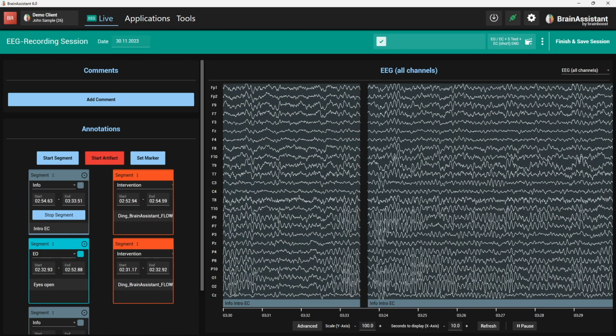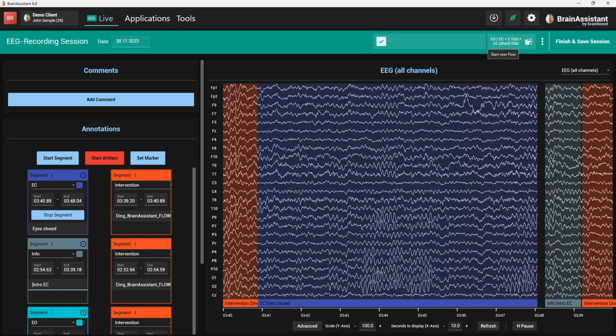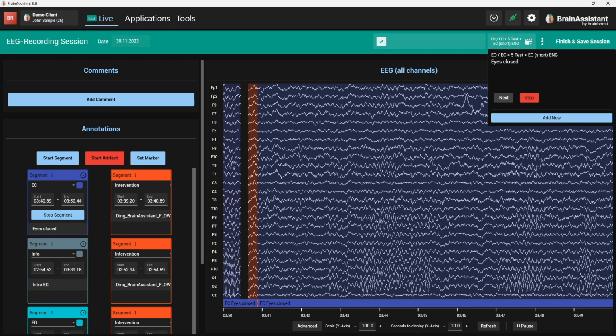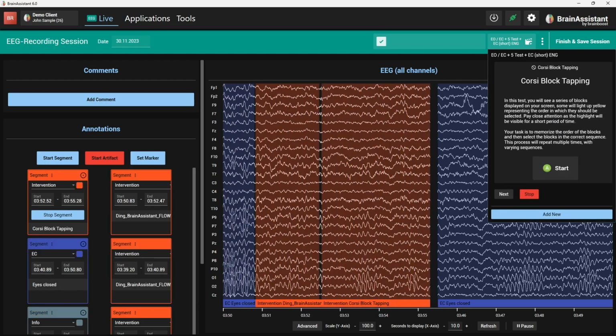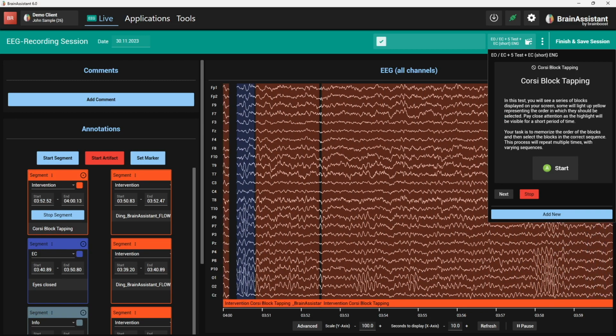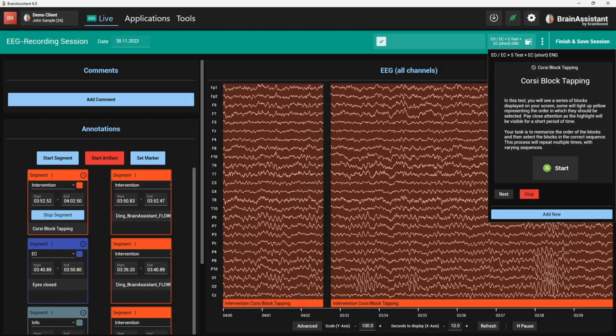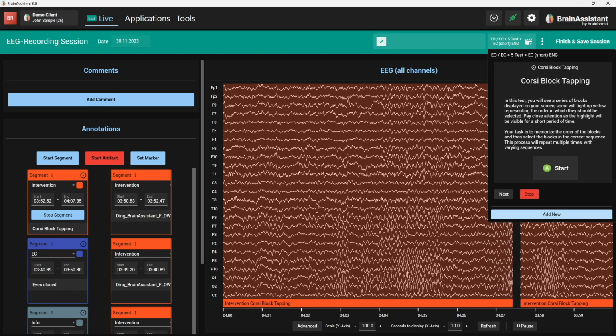So let's see what's going to happen next here. It says, nice job. Next, we repeat this with eyes closed. So I need to press A. Now there's a sound. Now there's a countdown, eyes closed. What you can always do is you can also, as a therapist, click here on this flow and say next. Now you see, we skipped, we heard this little sound. And now this is what I'm going to show you next. So when you restart a flow and you say, I'm not going to wait 3 minutes for eyes open, eyes closed again, I just want to get through to these tests I'm going to show you, then you can also skip something here with next.